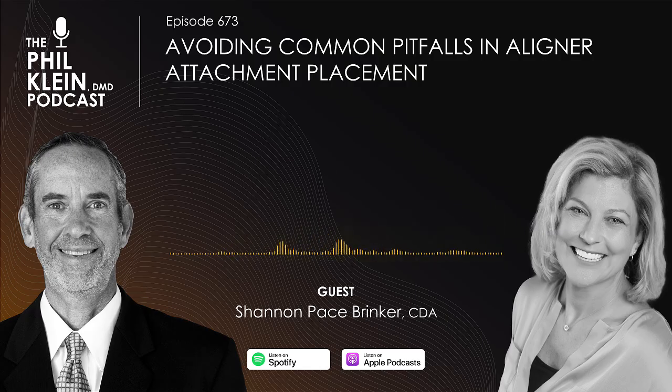So it's a no-brainer. The beauty, once we take off the template, is if you did that and didn't etch the whole tooth like everybody's doing, you can take a scaler and just flake it off, almost like your fingernail if you wanted to really, but just take a little scaler and it just pops off all over. I think you'll be shocked at how much flash just comes off instantly.